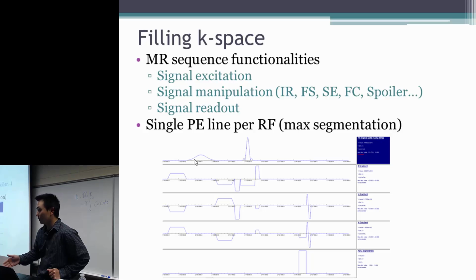instead of the water. During this RF pulse, it excites the fat signal, and then it gives some strong gradients as spoilers. So it just spoils all those fat signals. And then when you do an excitation for the water, there's only a water signal left for you to excite. So this is the fat saturation pulse here.